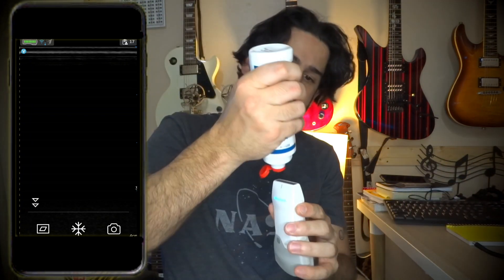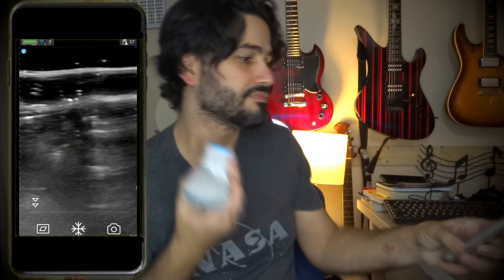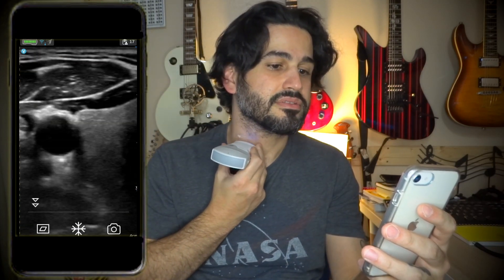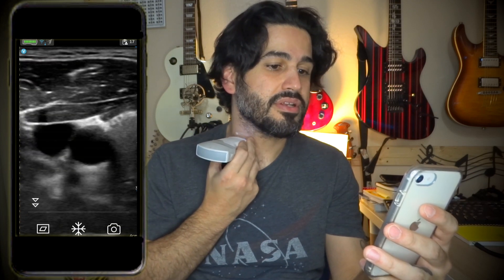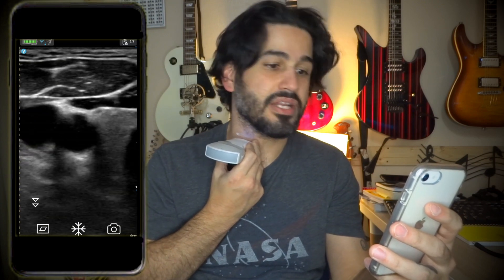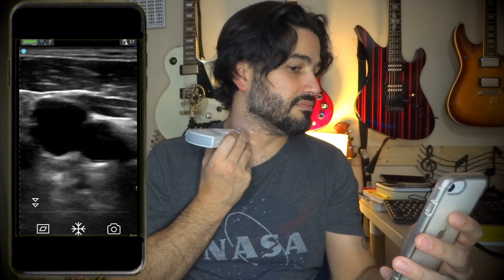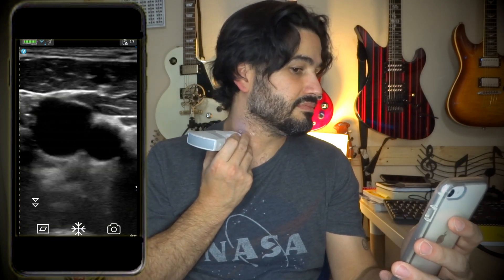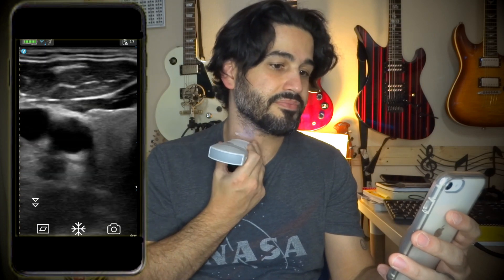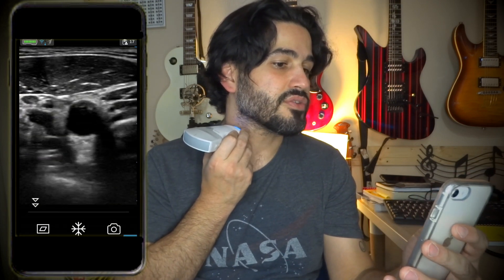Let's put some gel on here. As you can see, that's my carotid. Right next to my carotid is the thyroid, and that's my jugular. If I press hard it collapses the jugular, and if I take a deep breath and hold it and do a Valsalva — you can see it got bigger. There's a lymph node up top, and that's my sternocleidomastoid muscle.